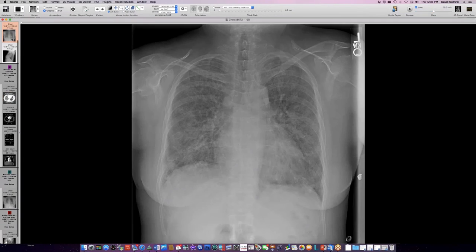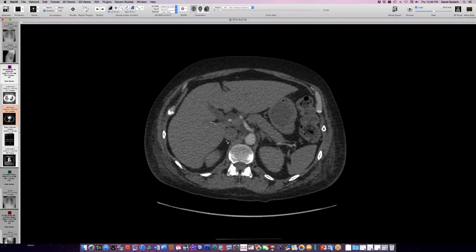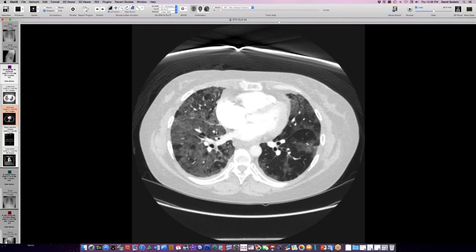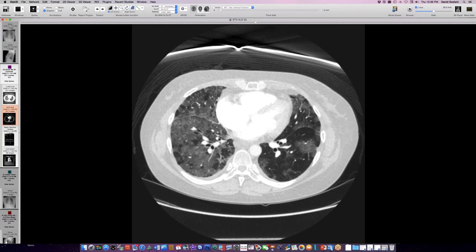So now her diffuse lung disease, at this point she's feeling better, has pretty much become symmetrical, involves the left lung to the same extent as the right almost. And she's got this dilation of her azygous vein here, which I think reflects her systemic venous hypertension, backing up here because of her pulmonary hypertension. So she was treated with steroids here because of presumptive fat embolism syndrome.